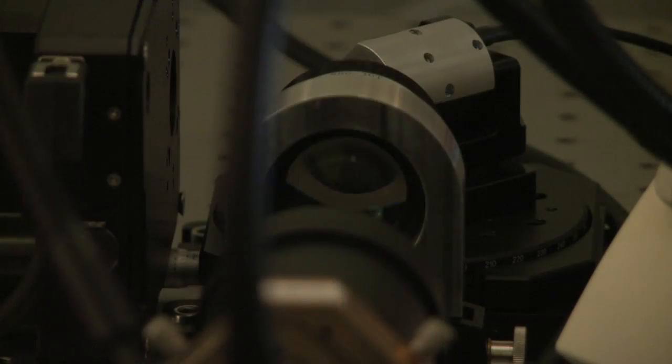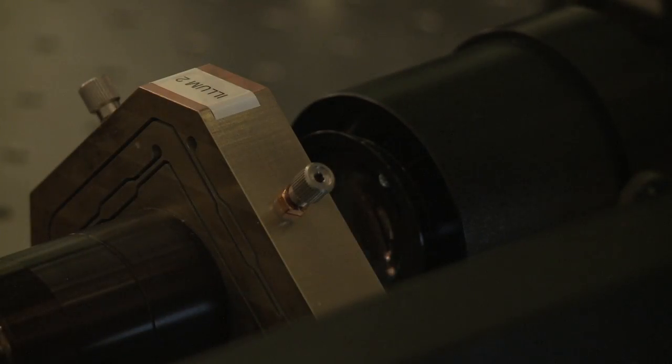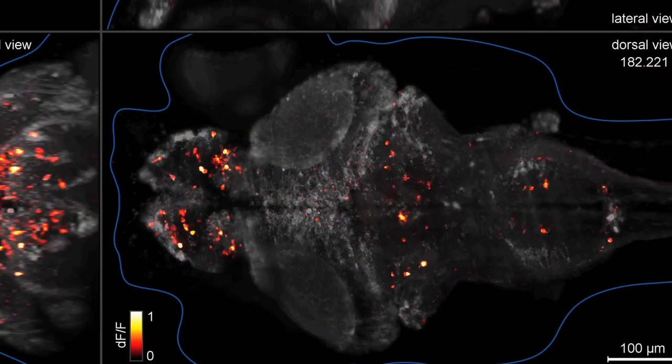The other next step is to increase the temporal resolution, so to be able to scan the brain much faster than we currently do. This is interesting from the point of view of the Brain Initiative, because a big part of that project consists of observing neural activity in every neuron in a brain, eventually, hopefully, big brains, such as mice or human brains. But I think this is a step towards achieving that, since we're able to look at activity in all the neurons of a fish brain, which is also vertebrate and has similar brain structure to other vertebrates like mice and humans.